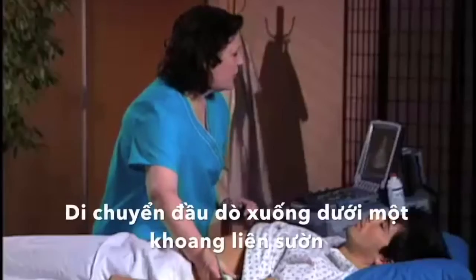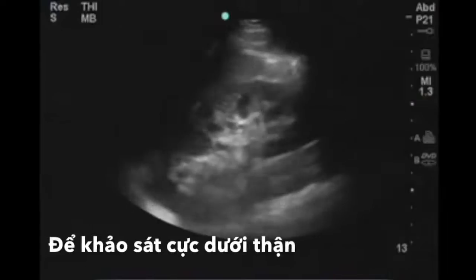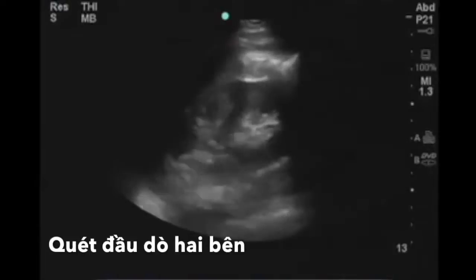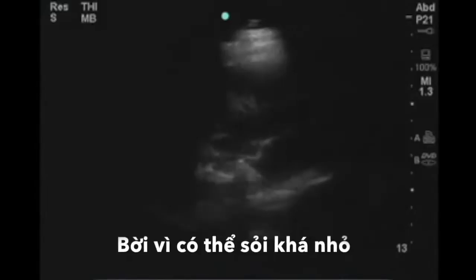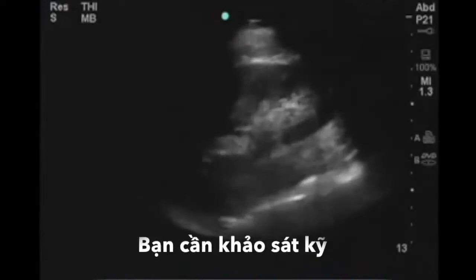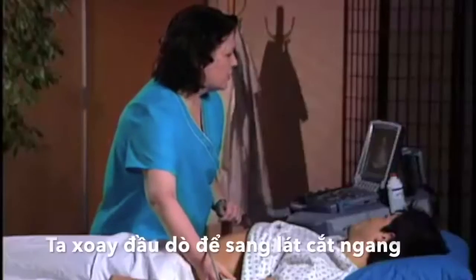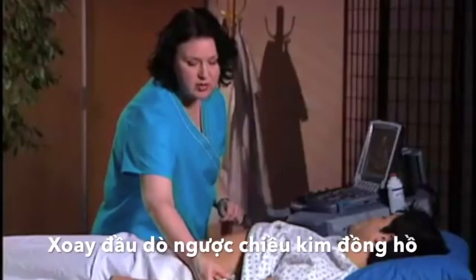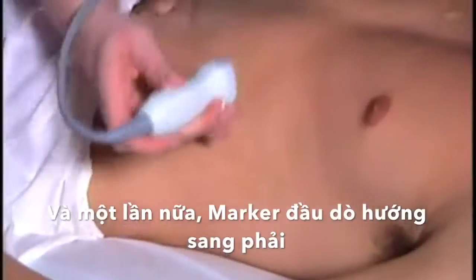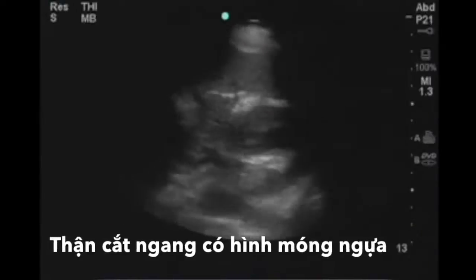Then I'm going to move down one rib space, evaluate the lower pole of the kidney, and sweep medial to lateral to make sure I've looked at all of the tissue, because these stones can be quite small, so you have to do a very thorough evaluation. Once I've completed this view, I'm going to turn the transducer counterclockwise to a transverse view, and the marker again will face the patient's right. This will give me that horseshoe-shaped appearance of the kidney.